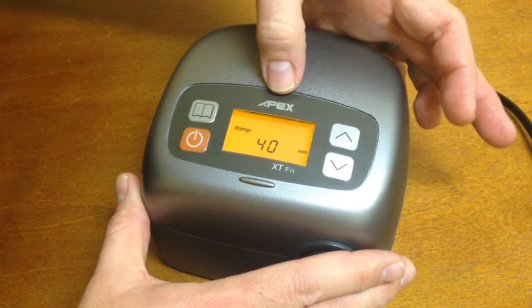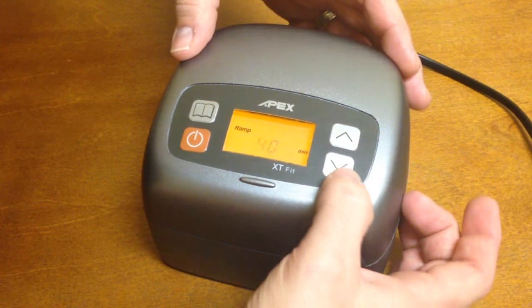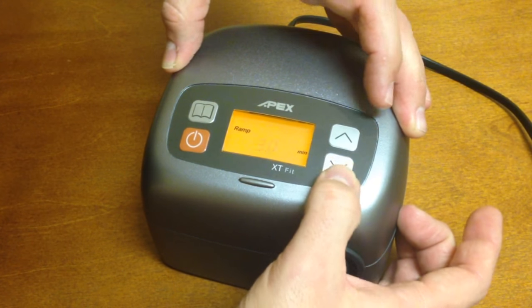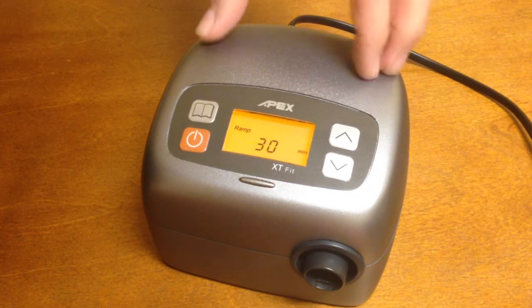If we wanted to change our ramp time, you would simply press the two arrows at the same time and that will start flashing. Then you just use the up and down arrows to change your ramp time. It goes in five minute increments. Once you have your desired ramp time, press the book button again and it will set that in.